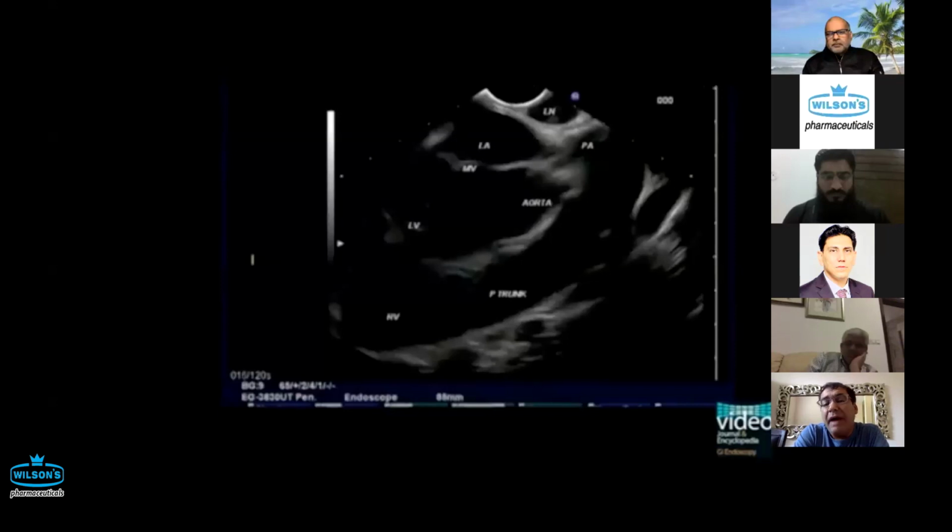And by the way, I always talk about the historical perspective of all these. The first FNA performed by EUS was a mediastinal FNA by Dr. Peter Vilmann. He performed the first FNA, and that was from a mediastinal lymph node. The mediastinum is the easiest place to do FNA, because your scope is really straight, and you can easily avoid vasculature and everything.